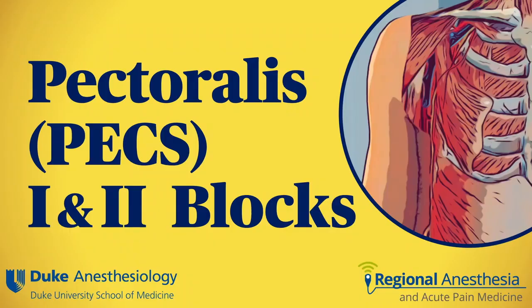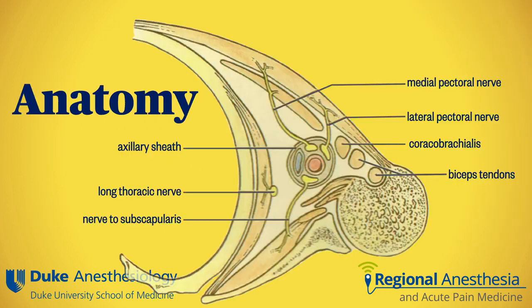The pectoralis or PECS blocks are a set of fascial plane blocks used for anesthetizing nerves of the chest wall, and in this video we'll discuss the anatomy, approach, and some tips for success for PECS 1 and 2. There are two PECS blocks, and they each serve a different purpose, although they're often done together.